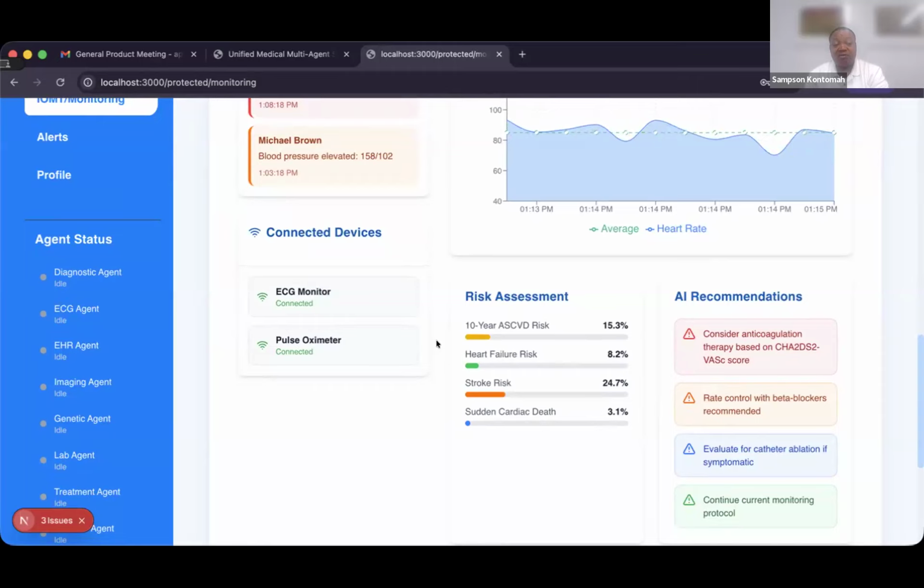Let's say a patient has been admitted for a heart attack or any severe cardiovascular disease, and they discharge them. They can still use this remote patient monitoring tool. Any device they are wearing will monitor them remotely and then send any critical data alert to the treatment team for proactive measures. So this is one of the important aspects of the multi-agent system product, as it is done to improve quality of life through this remote patient monitoring and also reduce mortality rate.